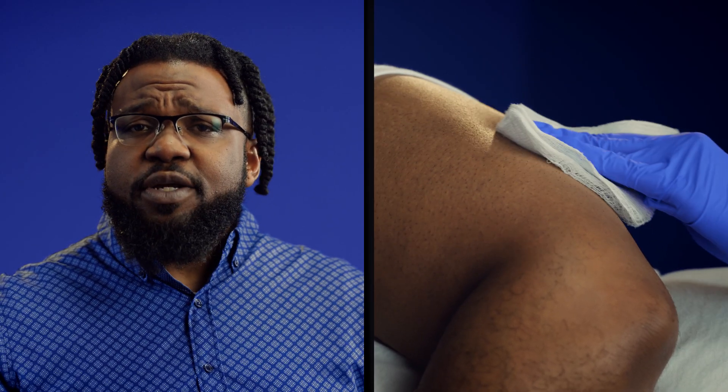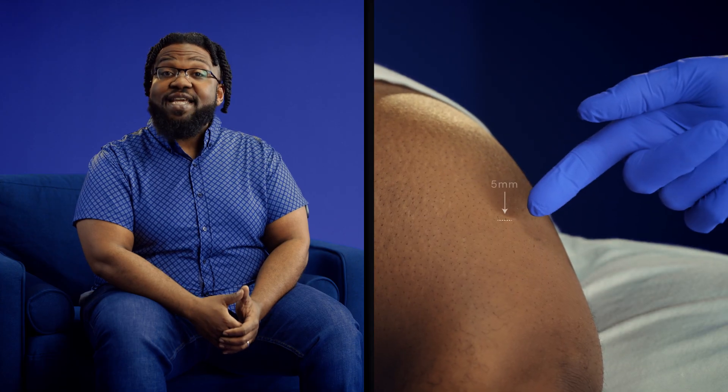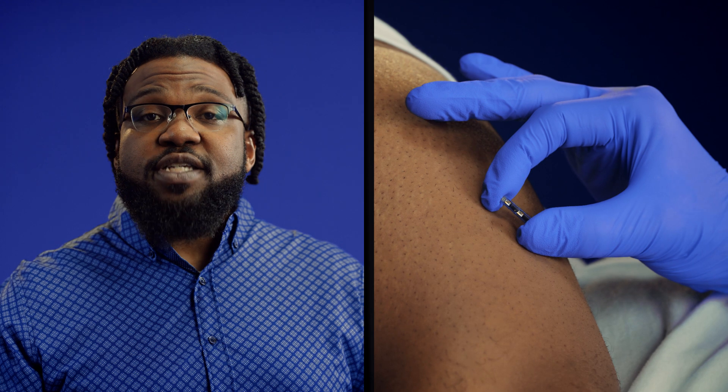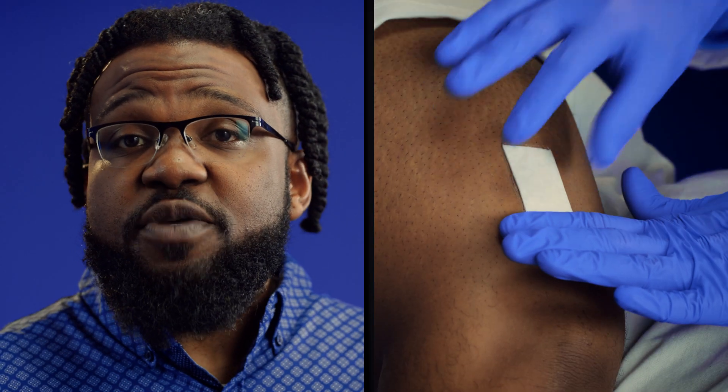The provider numbs the area with medication. You might feel a small pinch and maybe some slight pressure during the procedure. The provider makes a tiny incision just big enough for the sensor's width. They'll make a small pocket under the skin where the sensor will go and then place the sensor in it. A few adhesive strips and a bandage go over the incision. You don't need any stitches.